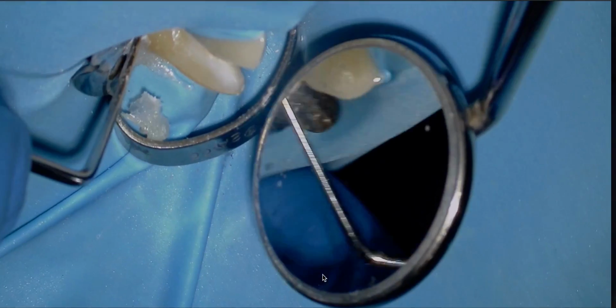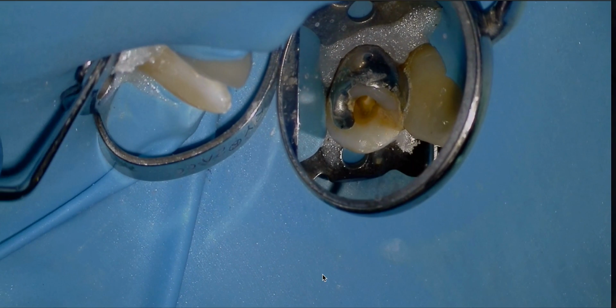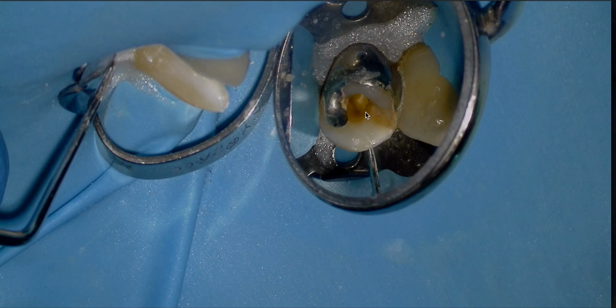So right there what I was doing is I was determining whether or not we need a post. I think there's no right answer in here, but there was a large abfraction lesion, and you can see right there the light coming through the buccal part of this.